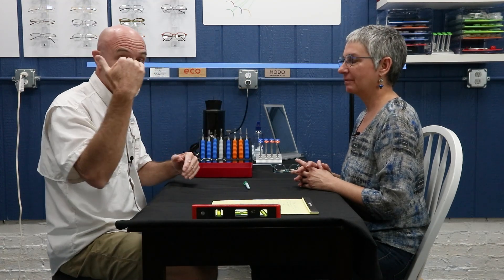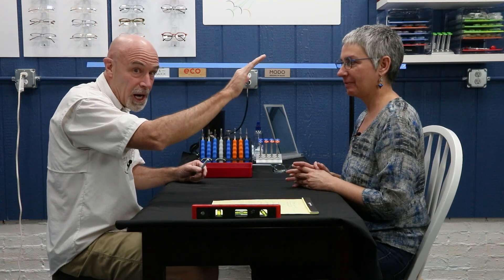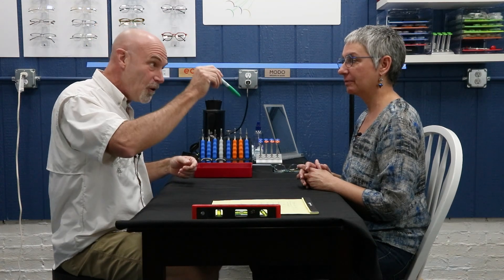You need to work at it. Practice this with your coworkers — role play and switch places. Stand where the camera is and see how well they maintain level. I have a tendency to duck in, which is not good. If you're vertically challenged and always looking up at people, you'll end up being high all the time — that's why these chairs usually adjust for the optician. If you're very tall, you're probably going to end up being low most of the time.